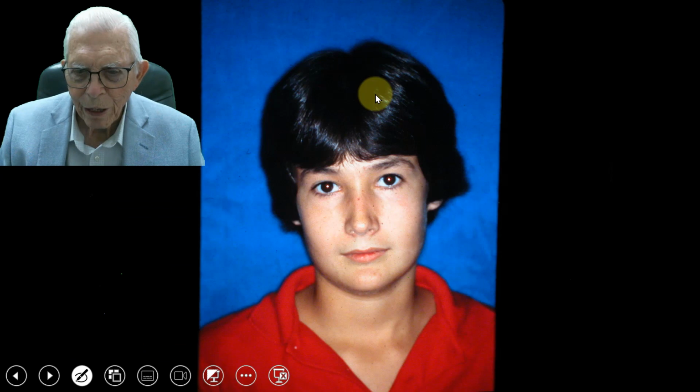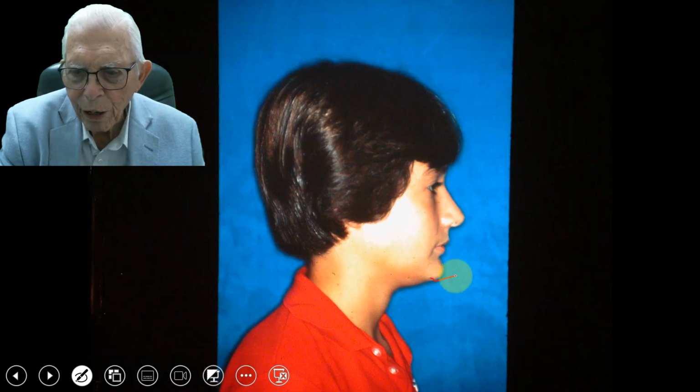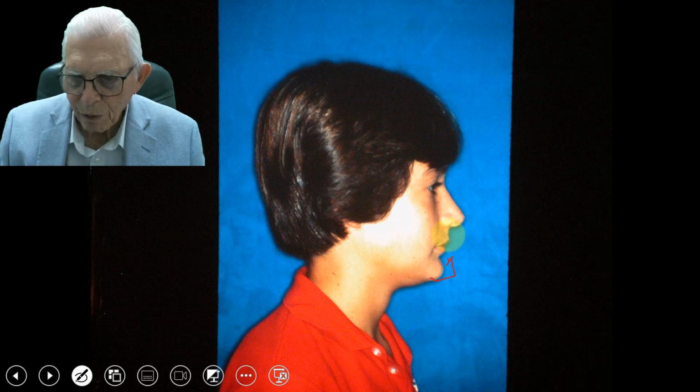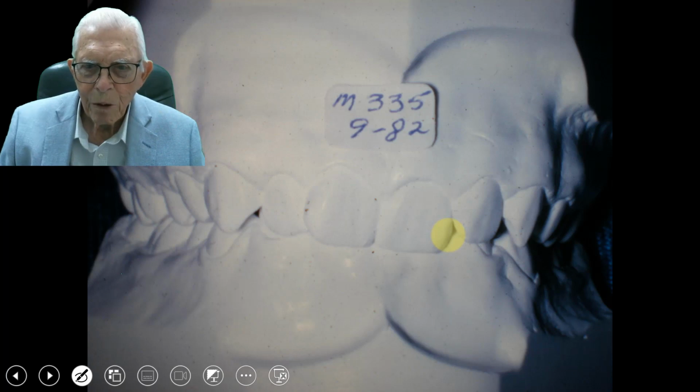Real nice young man. And you can see we wanted to bring the jaw out a little bit more. In this case, the case that we just showed back, we brought the upper back some. But here we're bringing the lower jaw forward some. And so you can watch that happen. Now, here is angled. This doesn't change this young man's facial structure hardly at all.